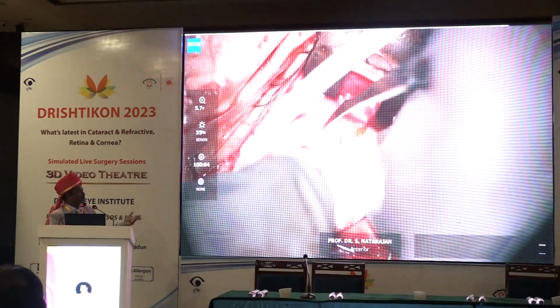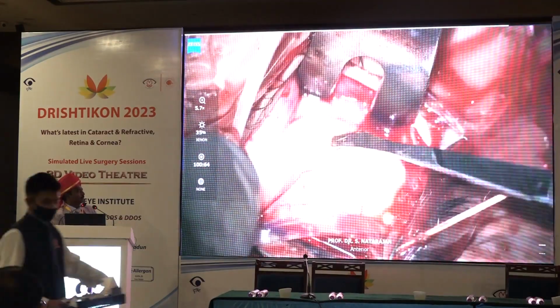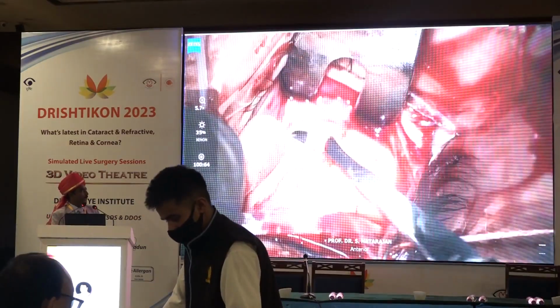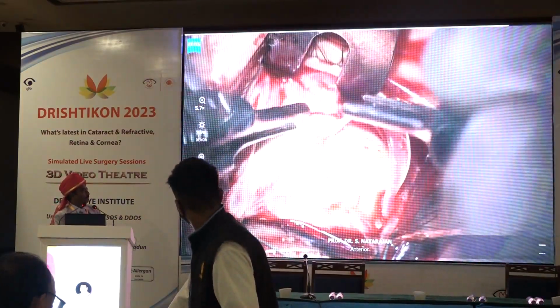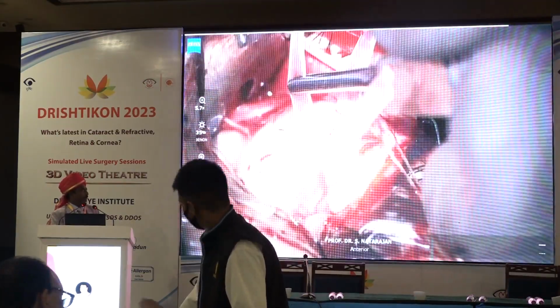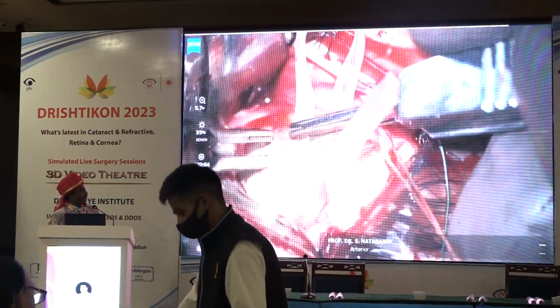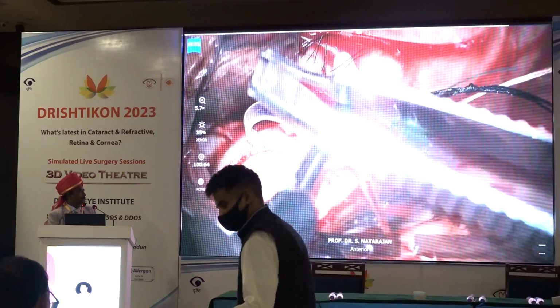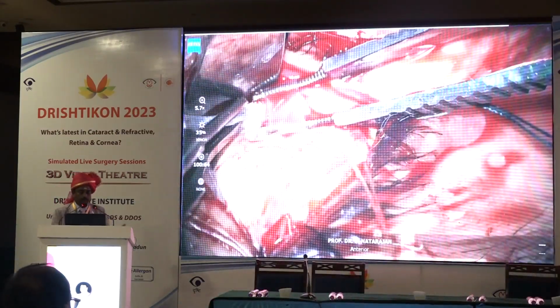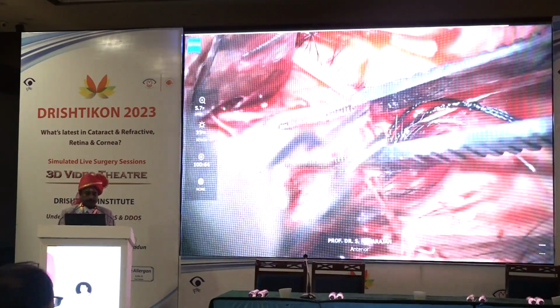So I actually choose between the muscle ring, which represents the ora serrata, and the vortex, which is the equator. So it's put in between to create an artificial ora serrata to prevent peripheral traction, which can produce breaks in the future. Most of the time, I think more than 95% of the time, with one surgery the patient can get 6/6 and N5.